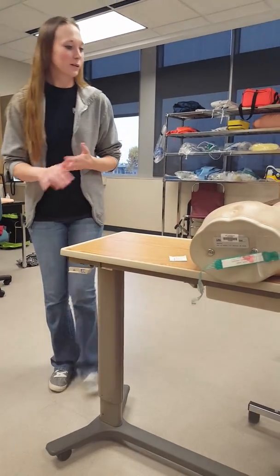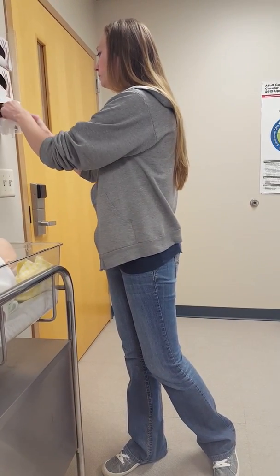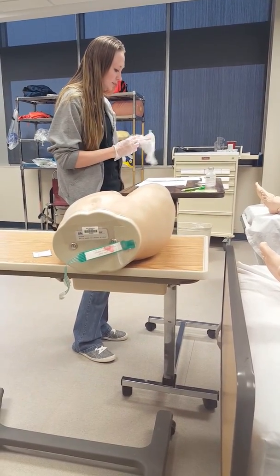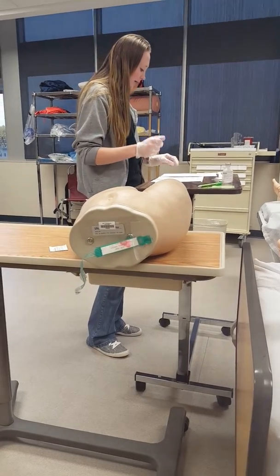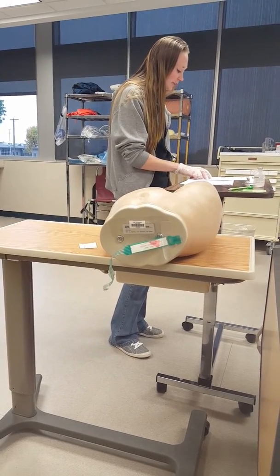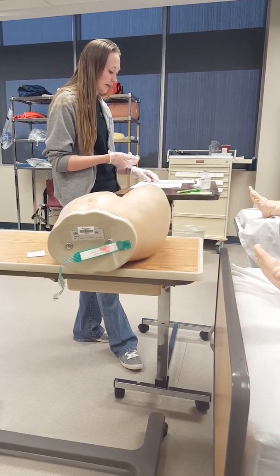All right, the next thing I'm going to be doing is giving you Demerol. And I wash my hands again. And I'm going to use gloves again. I'm going to check my doctor's orders and make sure that I have the same as my MAR and on my bottle. And I have Demerol, 100 milligrams IM, and I can give this every 4 hours, PRN for pain.